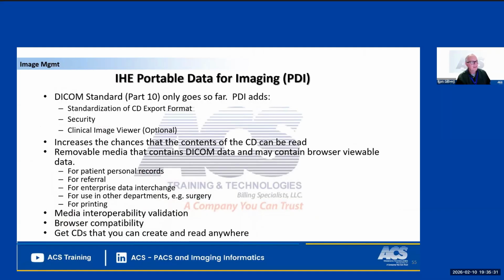And how does it know that the image is being displayed the same way that it was on the modality, the same way that it is on the technologist workstation, the same way it is in the radiologist workstation? You don't want to have any discrepancies. So we have frameworks and ways that make this work. And when we learn those, that's how we can tell what to fix.